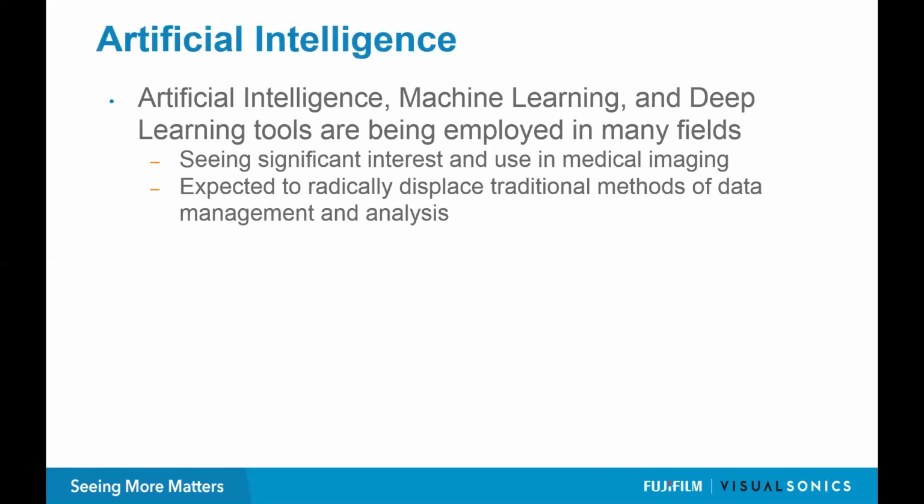In medical imaging specifically, there seems to be a significant amount of interest in artificial intelligence, machine learning, and deep learning tools. And some of the things that we're hearing and seeing is that the expectation is that some of the traditional methods of data management and specifically data analysis may be displaced by some of these tools.